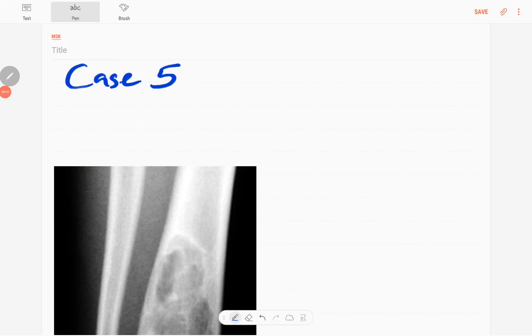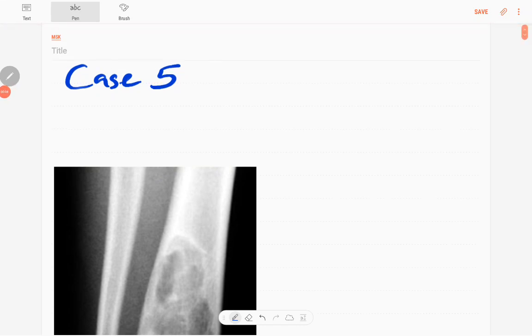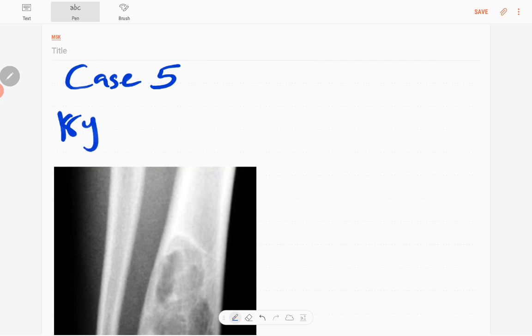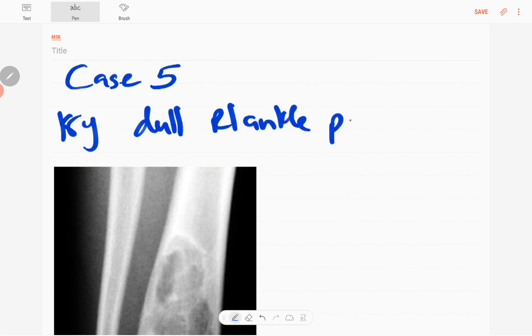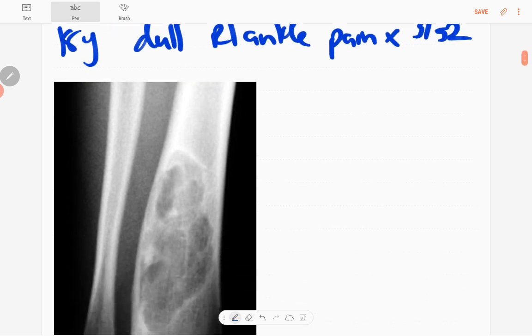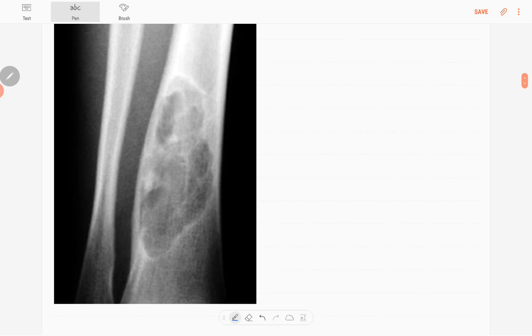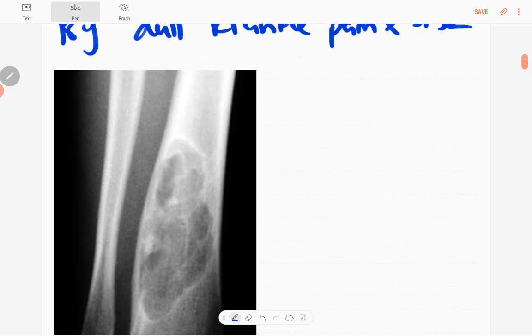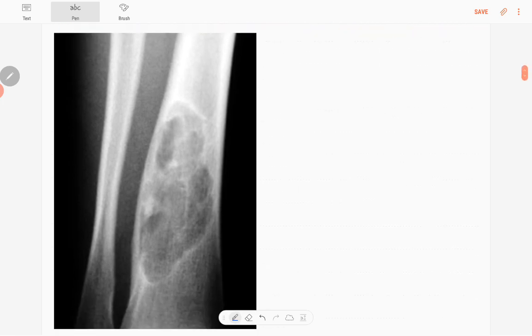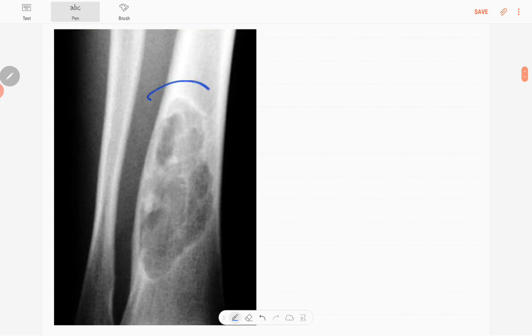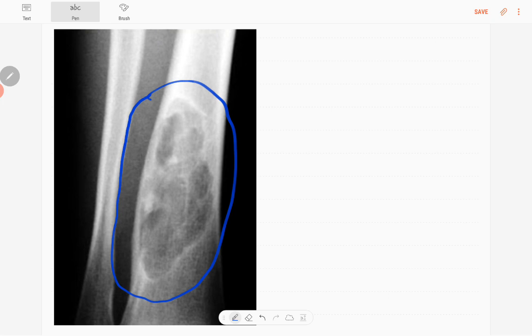Hi everyone, this is case number five of MSK series. This case is an 18-year-old patient presented with dull right ankle pain for three weeks duration. This is an x-ray, an anteroposterior radiograph of the right distal tibia and fibula in a skeletally mature patient. The abnormality is in this region, the distal tibial metaphysis and metadiaphyseal region.